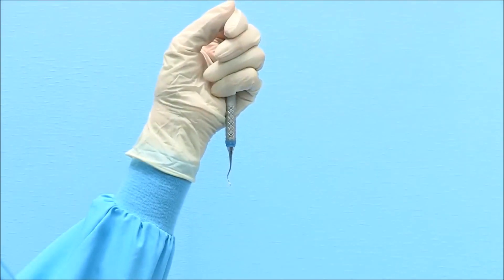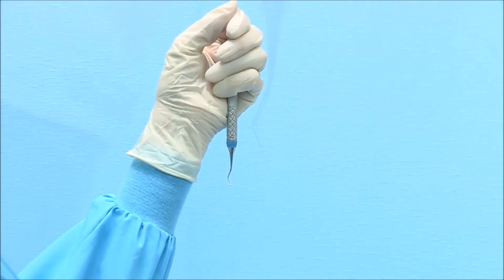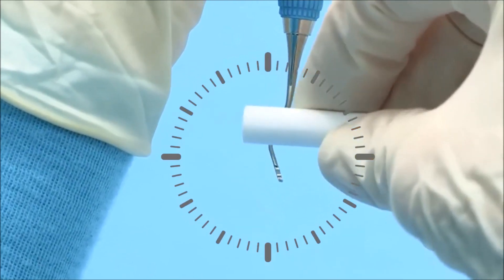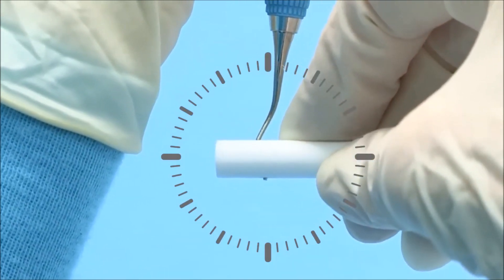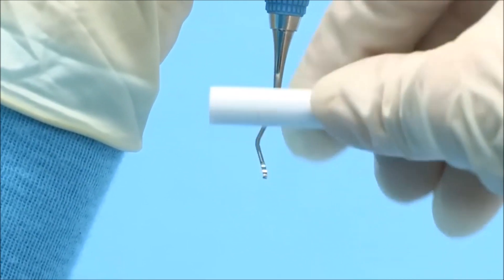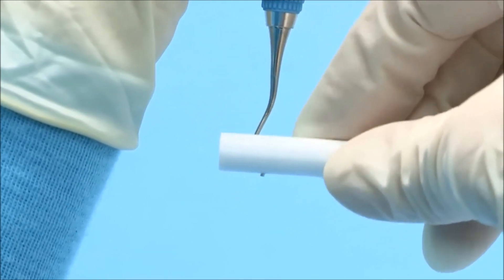Lastly, the facial surface can be finished. To do so, hold the terminal shank at 3 minutes before 12 o'clock with the toe pointed toward you. Position the cylindrical stone along the face of the blade horizontally at 3 and 9 o'clock. Lightly roll the stone along the face of the blade from heel to toe.